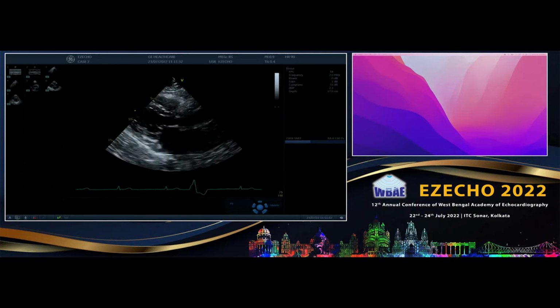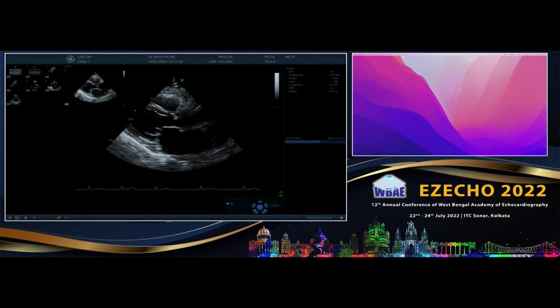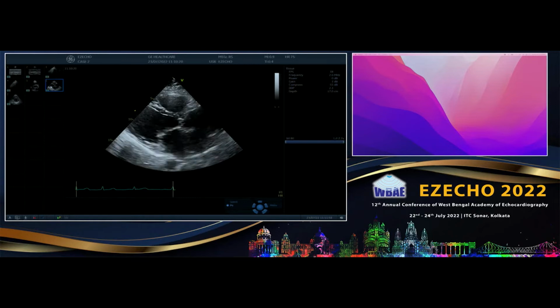So make it a habit to look for the mechanism of mitral regurgitation, and also the mechanism of aortic regurgitation. Whether the mechanism of AR is because of annular dilatation, root dilatation, or fibrosis and retraction of the cusp, flail cusp, and so forth. That will give a wealth of data. So think as if color Doppler does not exist, make up your mind, and then turn the color Doppler on later for the quantitative measurements.